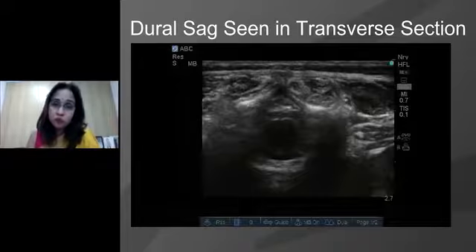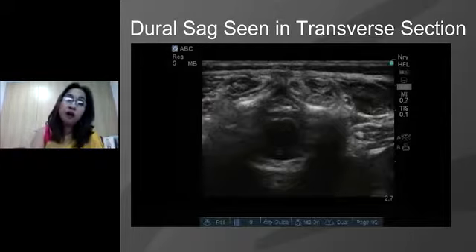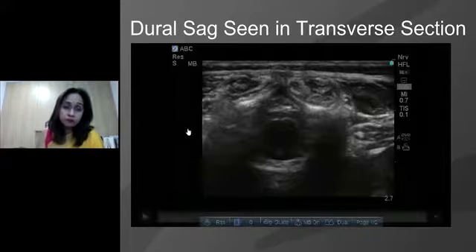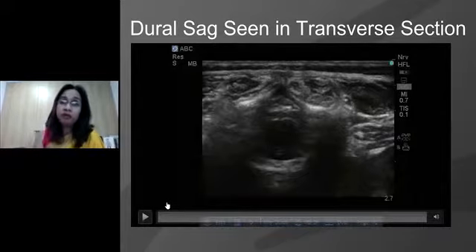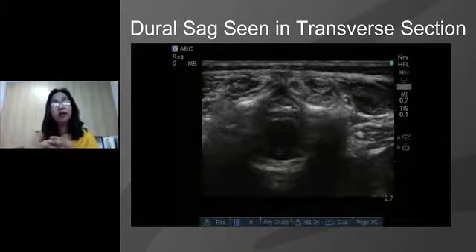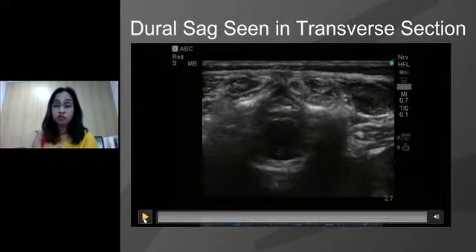How do we add objectivity? For this, we need two operators or two anesthesiologists, one who is efficient in carrying out the lumbar puncture and the other who can actually follow the lumbar puncture, in the sense, maybe one or two levels above the level at which the epidural is given. We need two experts for this particular work. And the sterility has to be precise. We can ensheath the entire ultrasound probe with the camera cover, and then we can either put a Tegaderm on it or we can put a glove on it and make it totally sterile. Because central neuraxial blocks, the two continuous ones, need a lot of respect, and they have to be done in one of the most diligent manners, especially the asepsis.